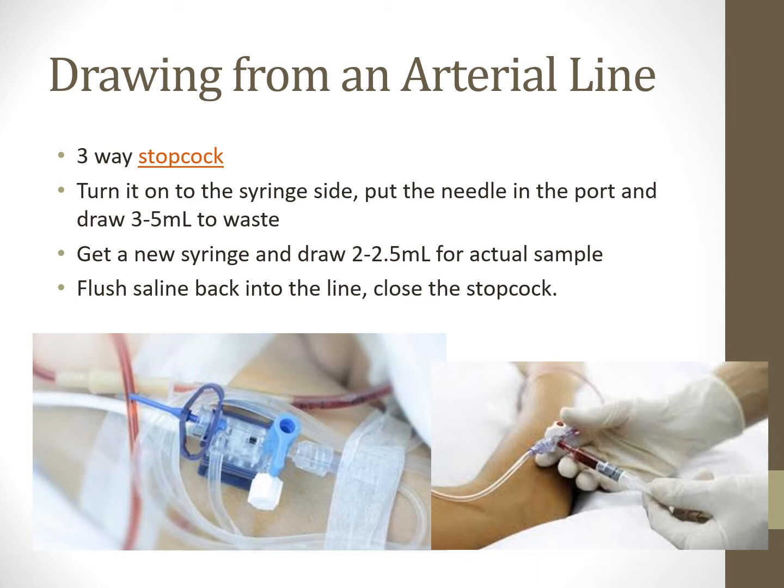It's not going to be accurate. So you're going to pull back a waste, and then you're going to get your sample, and then you're going to put that waste back in if you have one of those inline systems. Now, if you don't have an inline system and this is an adult, you would in theory throw away that waste, because putting the blood back in or putting that mix back in could actually cause more harm.